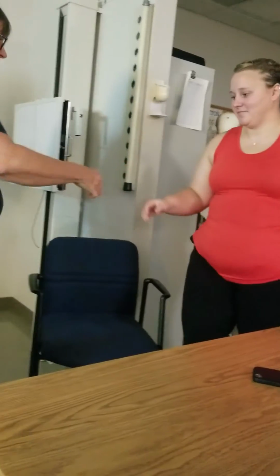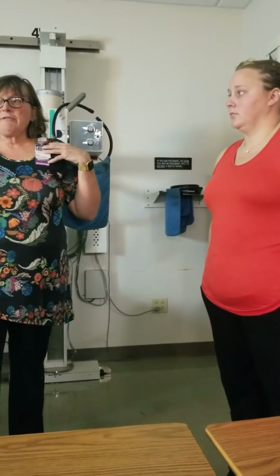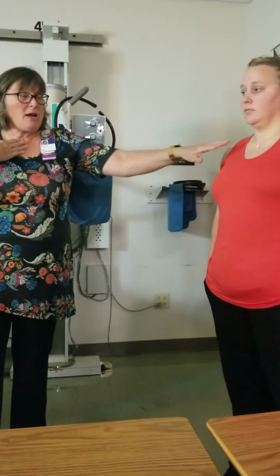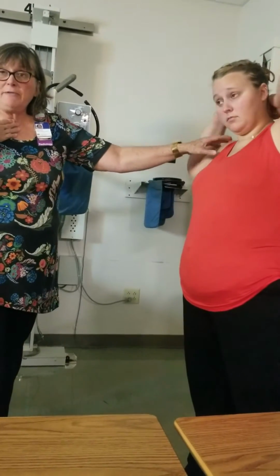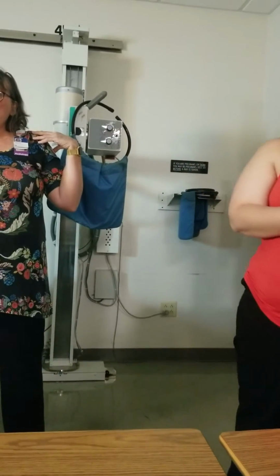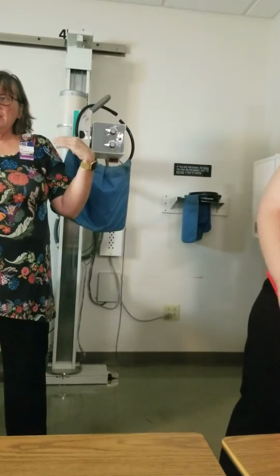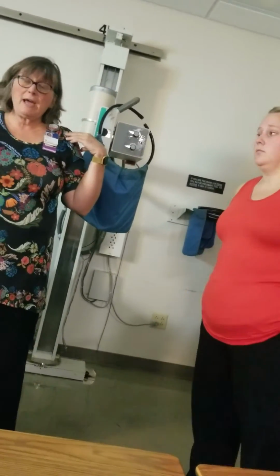So we're going to go ahead and get started. So good morning, Ellen. My name is Kathy. I'm going to be your radiographer today. I want you to come on in. Now, since we're doing the shoulder girdle, what am I going to have to do for artifacts? I'm going to have her take her necklace off because the AC joints, her clavicle's right in here, so her necklace would come off. Women have bra straps, so generally I get those people dressed in a gown so that their bra is gone. Does that make sense? So we're going to have her take her bra off. We're going to have her put a gown on, so everything from the waist up off for this image.